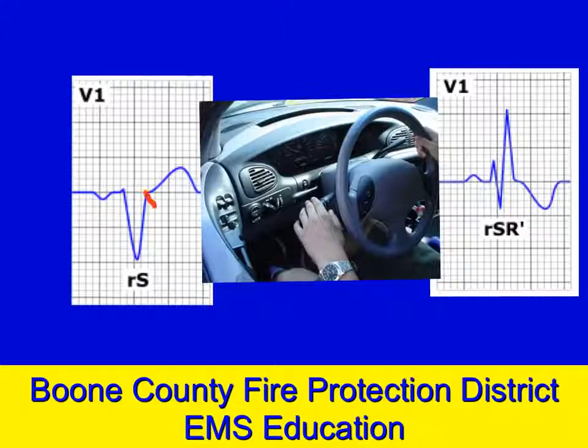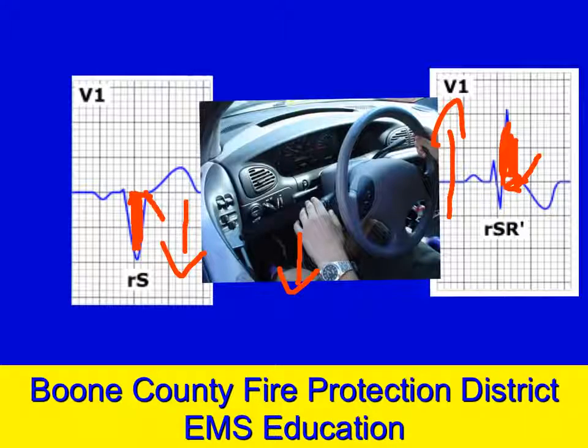You find the J point, which is the end of your QRS complex and the beginning of the ST segment, and from the J point you draw back into the complex and color it in. So what we have here is a primarily down pointing complex, which gives you the left turn. That's a left bundle branch. So over here on the right you find that J point, you color back into your complex. We're pointing up, so that would be signaling for a right turn.